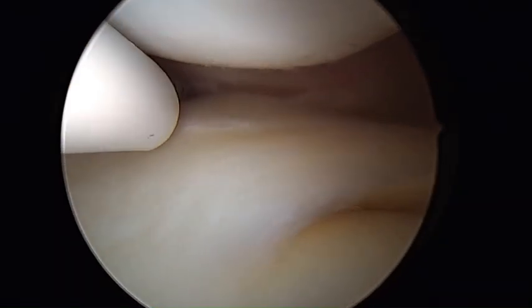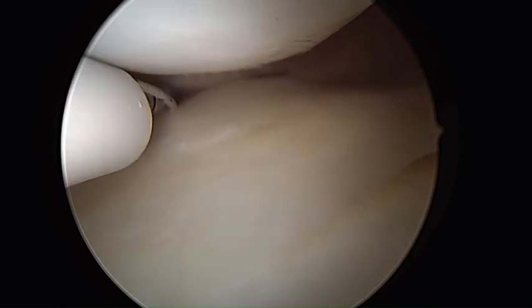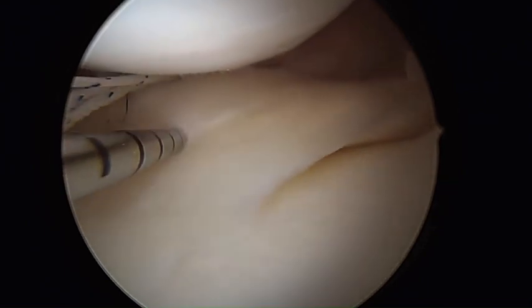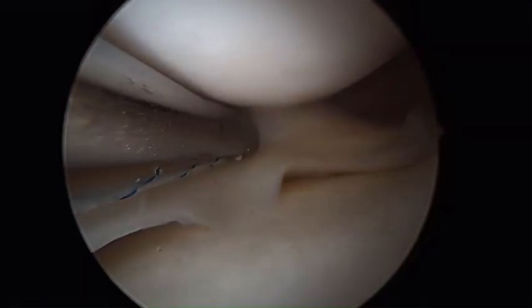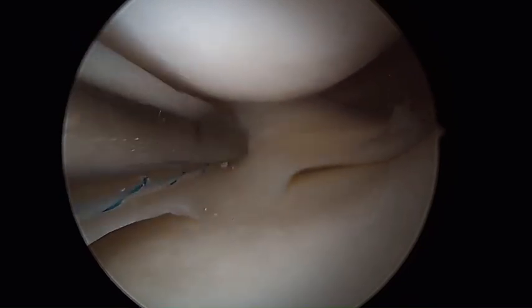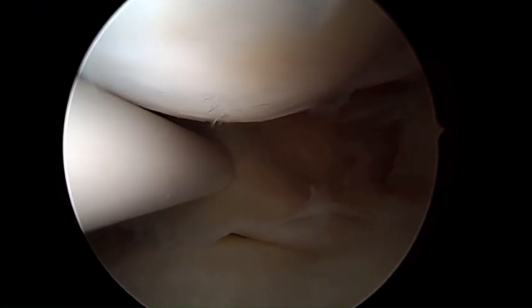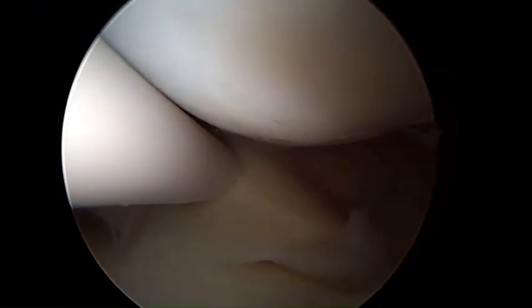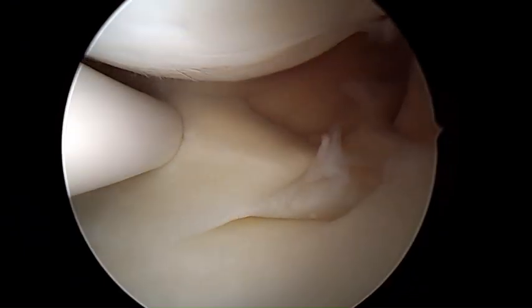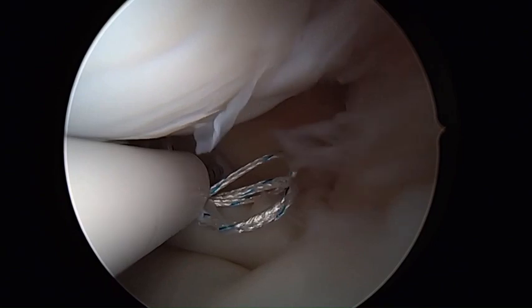The second FosTFix 360 device is introduced next and posterior to the first stitch. The first needle is passed through the capsule and second needle passed through the meniscal tissue. The third all-inside device is passed more posterior and again introduced in the capsule and meniscus in vertical configuration. This vertical repair can be repeated in the same manner depending on the length of the ramp lesion.